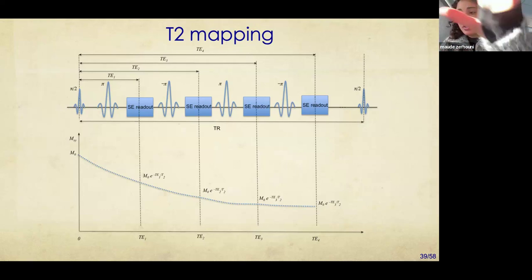It's actually a very old technology, because without it, you would just lose the signal in the transverse plane right away. And then you would need to image so fast that your images are never going to have good signal to noise ratio. Okay, I understand. So in reality, there are ways of imaging without this compensation mechanism. And those are really good if you want to image something that has very short T2 values. For example, if you want to directly image myelin, then you don't have time for this kind of spinning.